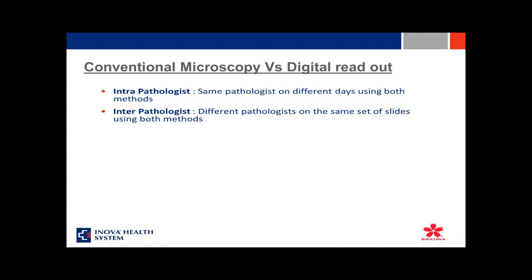So the pathologists were reading the slides manually, giving off a score. And then there was a washout period of 3 weeks between both the reads, and then the pathologists were reading the same slides and issuing the score. This was also validating their skill on how well they could diagnose using an image. And once we determined them to be qualified, we used the same pathologists in our future image analysis studies.